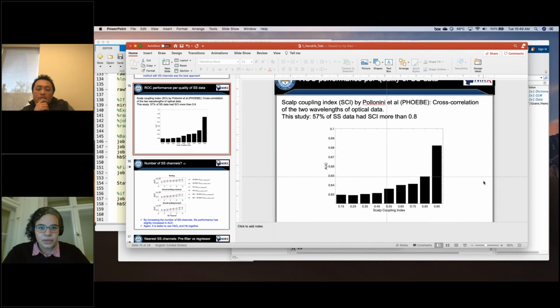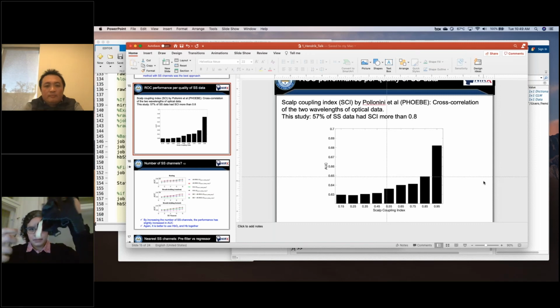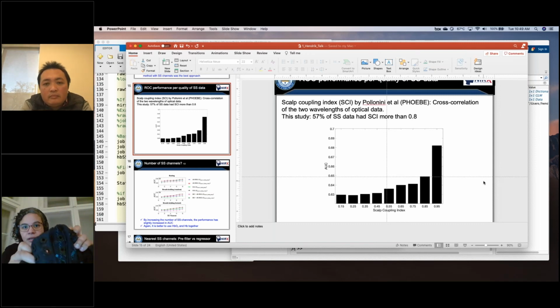You can also talk about your experience, Hendrik, but from our experience, to ensure a good signal and a less noisy short separation channel, for example, here I have a cap with our short channels. You see the cap, the bundle is here, and the short channels are here below the cap, as you can see.